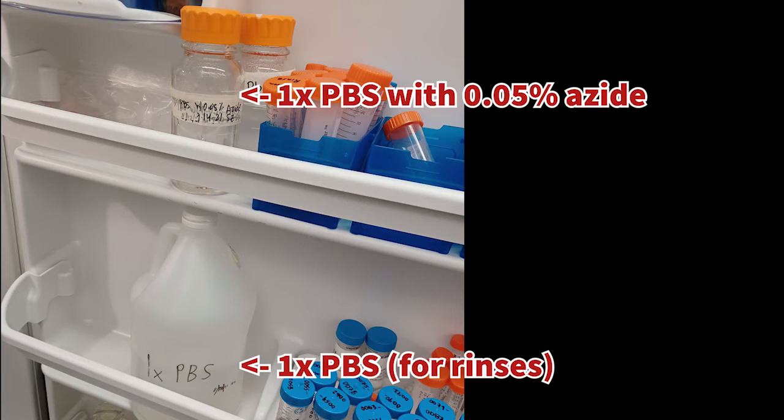In order to do rinses and prep for storage, you will need to grab the containers for 1xPBS and another container for 1xPBS with azide from the fridge door, pictured here.